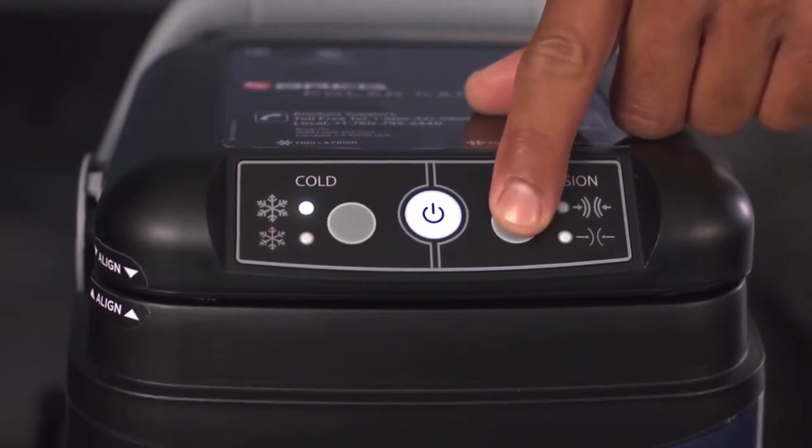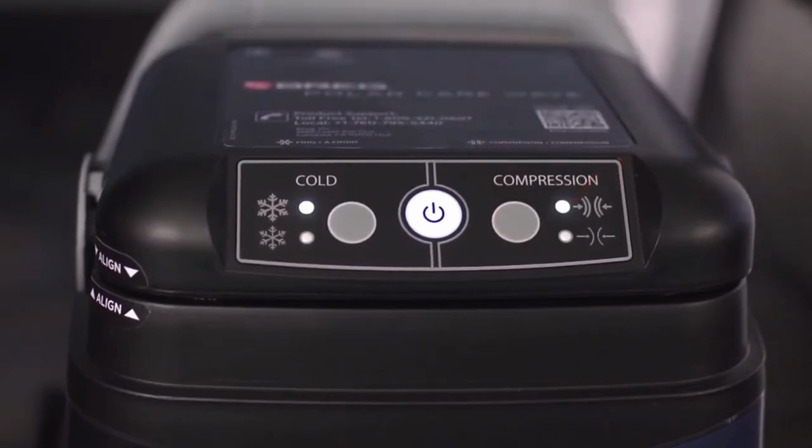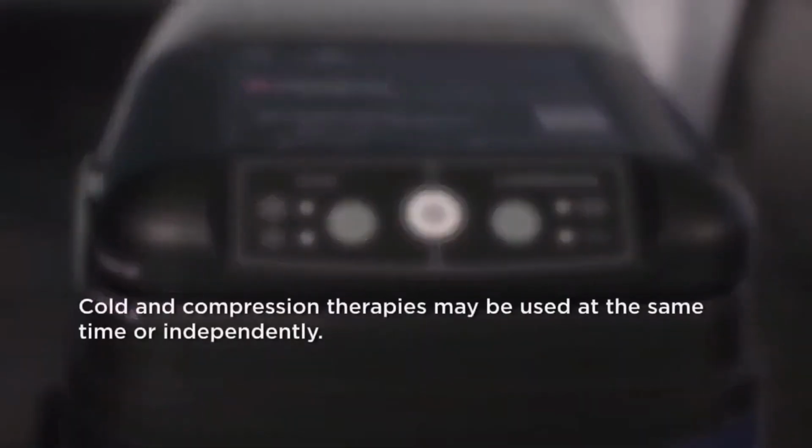Press once more to return to the regular setting. To turn the unit off, press the on-off button. All the lights will turn off. Cold and compression therapies may be used at the same time or independently.